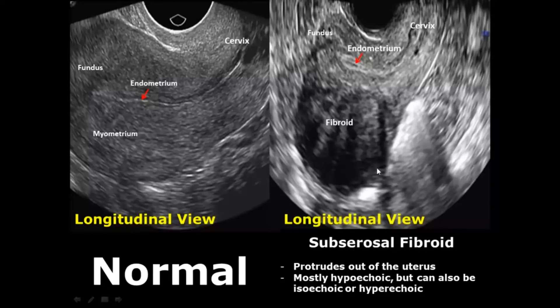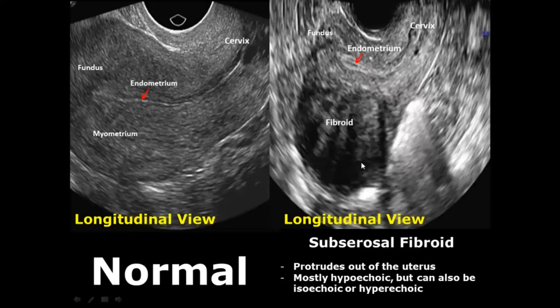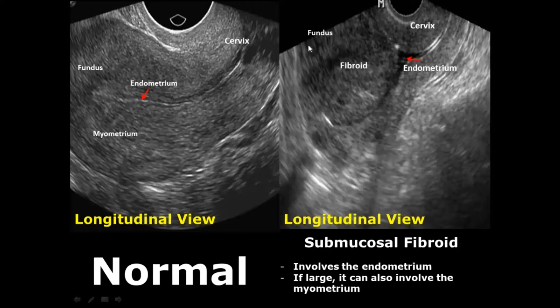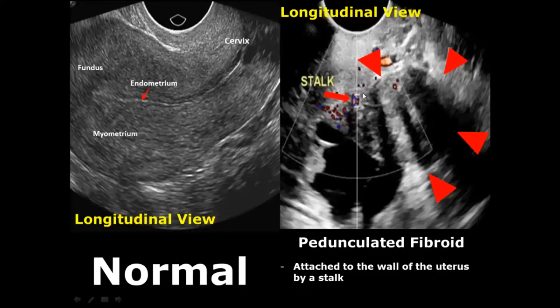The subserosal fibroid will protrude out of the uterus and also appears hypoechoic most of the time. The submucosal fibroid involves the endometrium, but if large enough can also involve the myometrium. The pedunculated fibroid is present in the endometrial canal and is connected to the endometrium by a stalk — we can see blood flow within the stalk on Doppler scan. This one has some calcifications giving posterior acoustic shadowing.